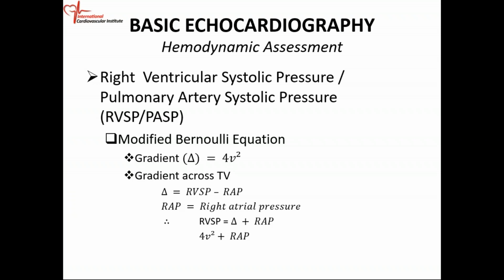So if you can calculate the RV systolic pressure, you will know what the pulmonary artery systolic pressure is.